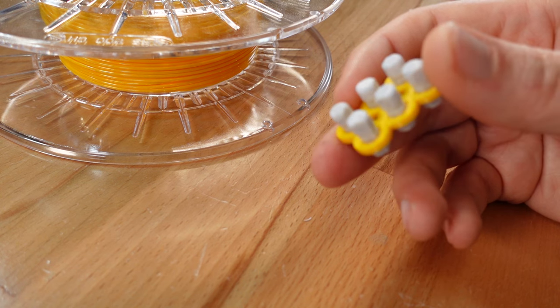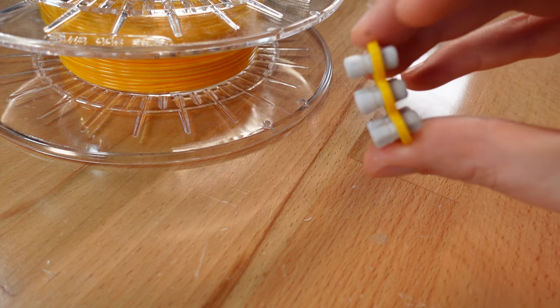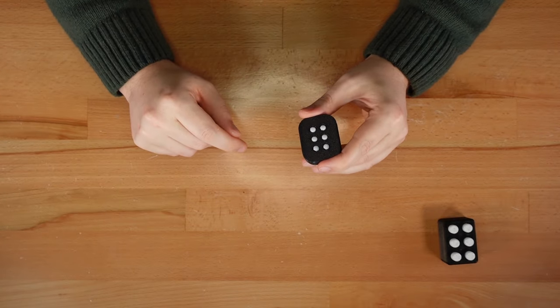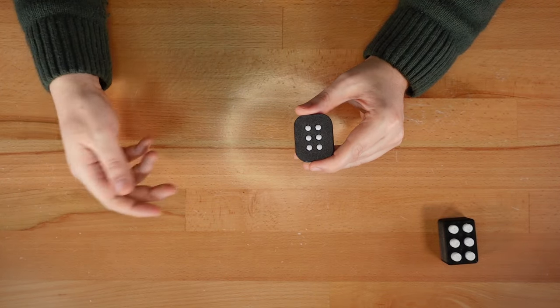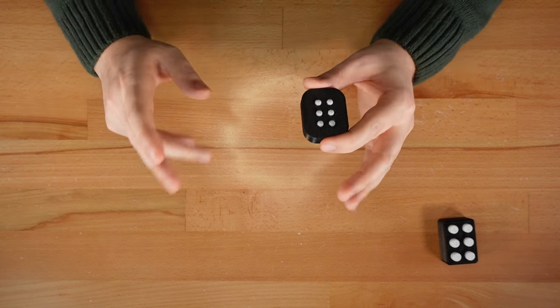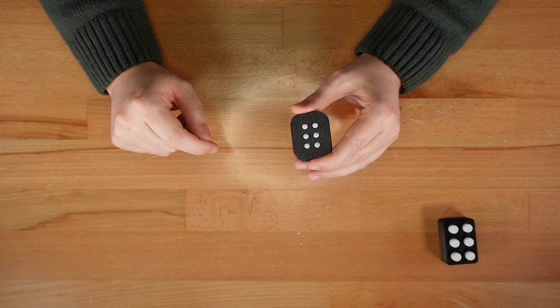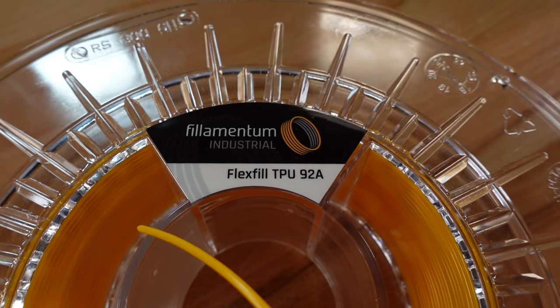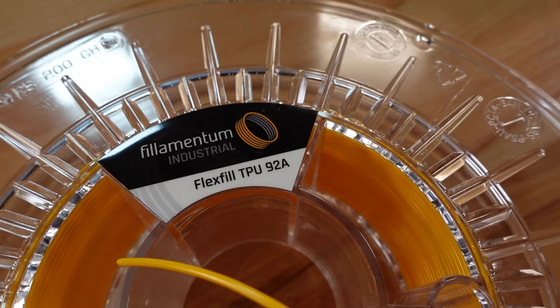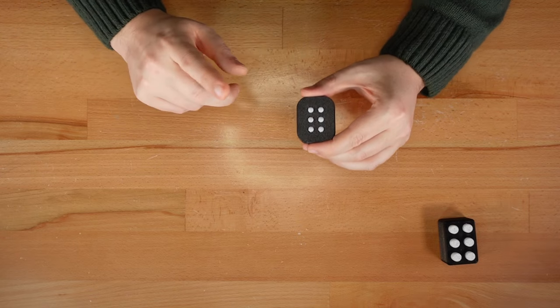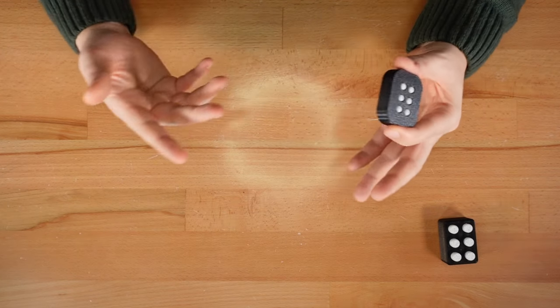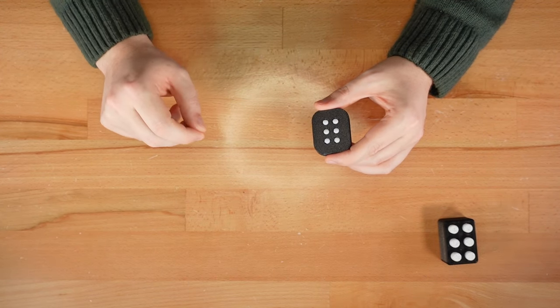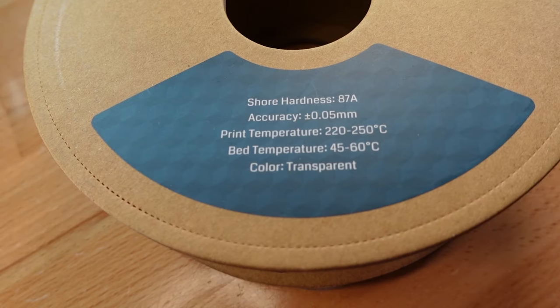This braille cell uses 92a TPU by filamentum. The 92 refers to its shore A hardness. The higher the number, the more stiff you can expect the buttons to feel. Some manufacturers include this value on the filament spool or packaging, but many others don't list it at all. So if you plan on printing this design, look for filaments that are explicitly labeled 92a or even softer.